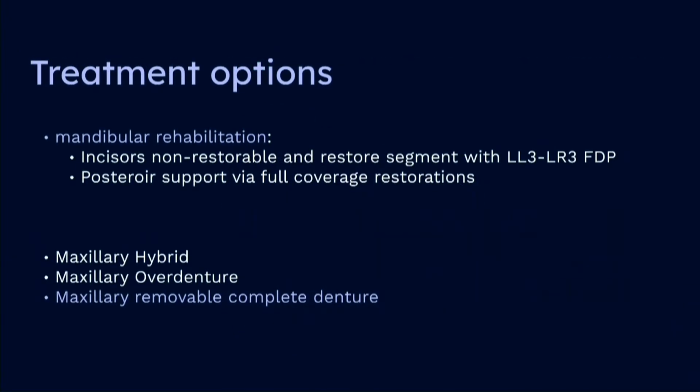Therefore, I presented the patient with a mandibular fixed rehabilitation via monolithic all-ceramic restorations, opposing a maxillary complete denture that is fixed or removable. The patient did prefer a fixed alternative, but due to finances again, elected for a conventional removable denture. Luckily, in this case, the maxilla presents with fair to good anatomical expectations for support, stability, and retention to host a complete denture.